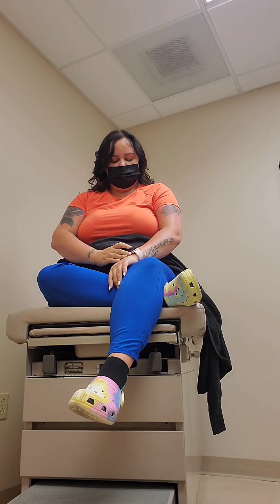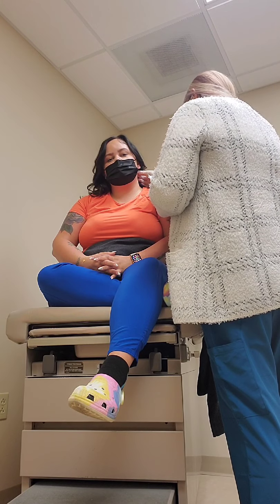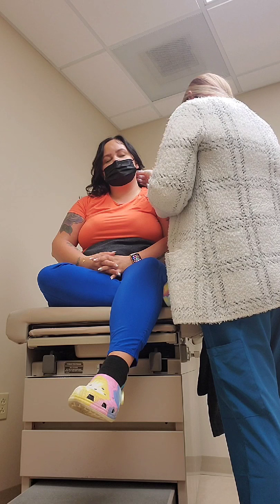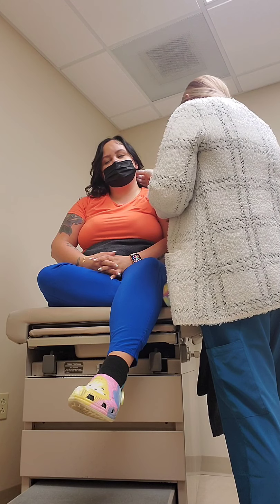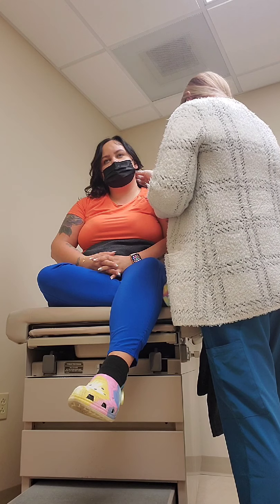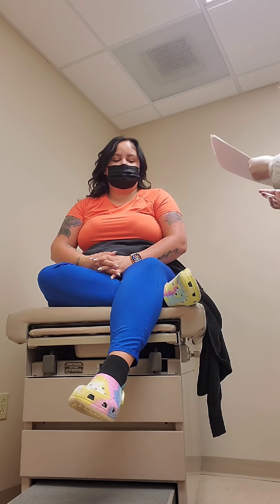Okay, so to create the sound, you're going to hold the tuning fork at its base, strike it gently to the heel of your hand, and see if the patient's able to hear it. Okay, you're going to place a tuning fork on the mastoid process. It's going to be about right here behind the ear. Okay. And then you're just going to hit that tuning fork, and the patient should hear the sound of the tuning fork. And then the patient should let you know when the sound has faded away.